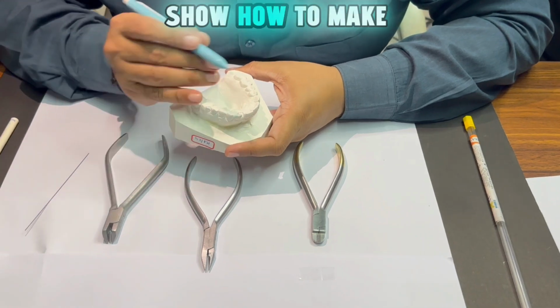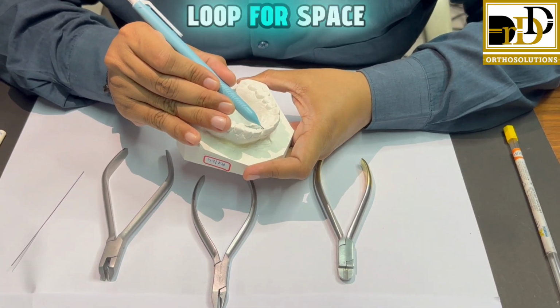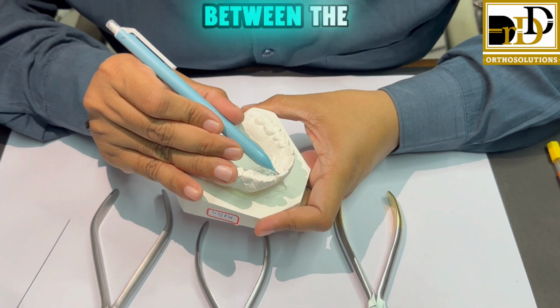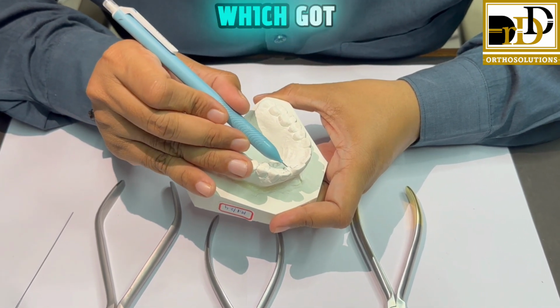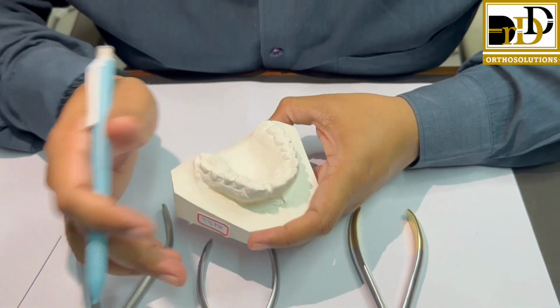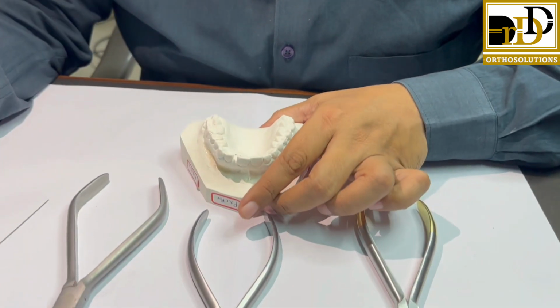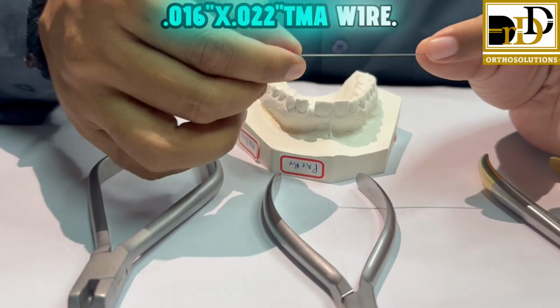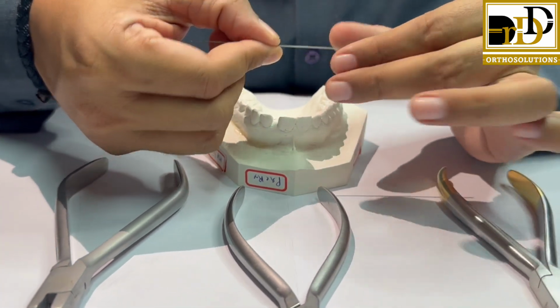Going to show how to make a loop for space closure between these two teeth, between the central and lateral, which got developed because of the cyst which was there between these two teeth. So for that I'm using 16x22 TMA wire.